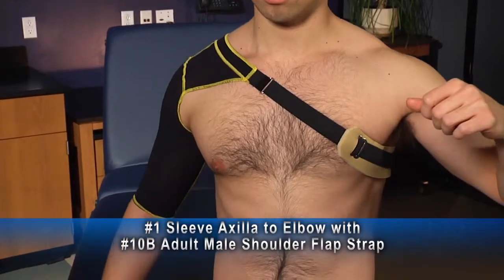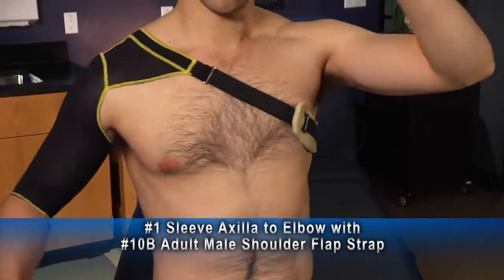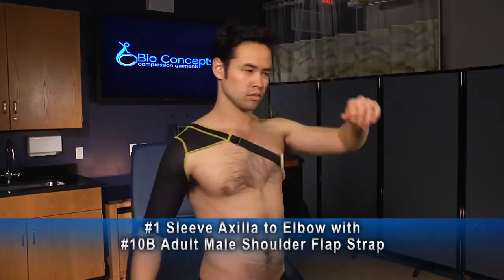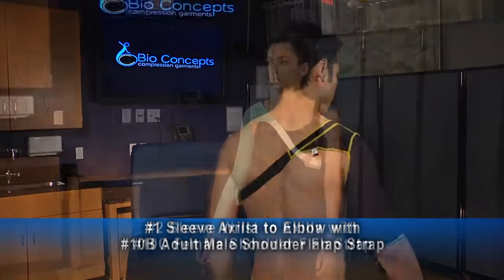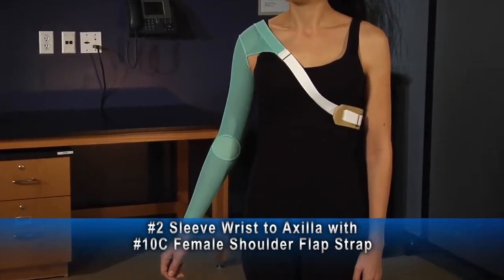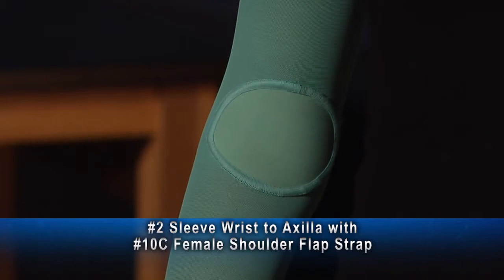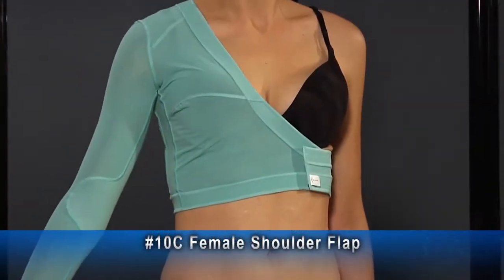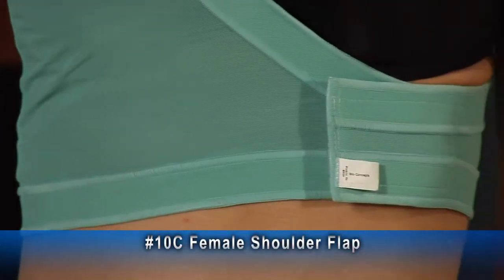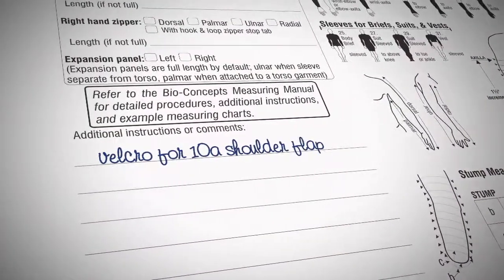This number one sleeve axilla to elbow with number 10B shoulder flap strap for an adult male has an adjustable strap around the torso, and the foam piece protects the skin from the strap itself and helps keep the sleeve in place. This female shoulder flap with sleeve to axilla pressure garment is shown here with an optional anterior elbow insert to prevent the irritation that can occur with bunching of the fabric in the elbow crease. This sleeve to axilla has a female shoulder flap, an adjustable velcro and expansion panel extending down the side of the shoulder flap. If these or any other options are desired, they must be specified on the measurement chart.